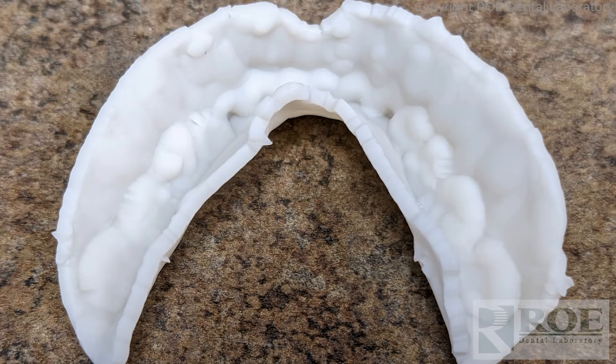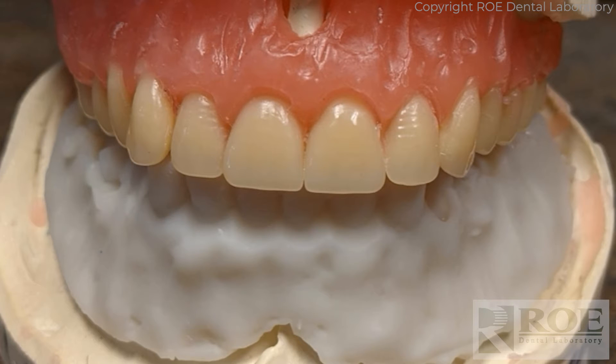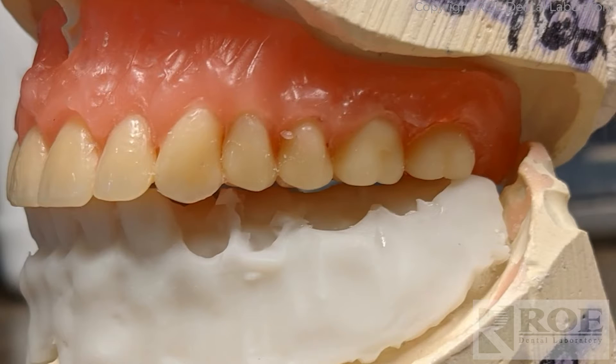Here's the intaglio of it — it's hollow, perfect for doing a reline impression. When the teeth were off, the bite was acceptable. We're going to do a little manipulation in the mouth to get it just right.